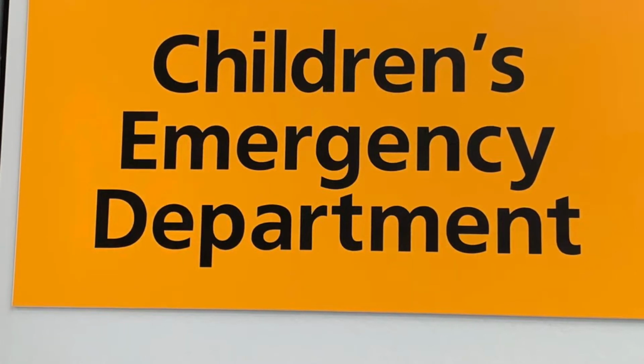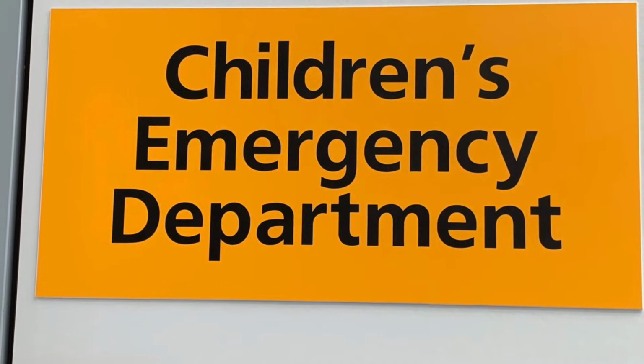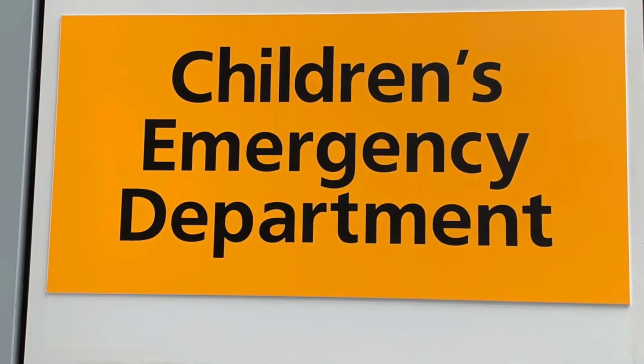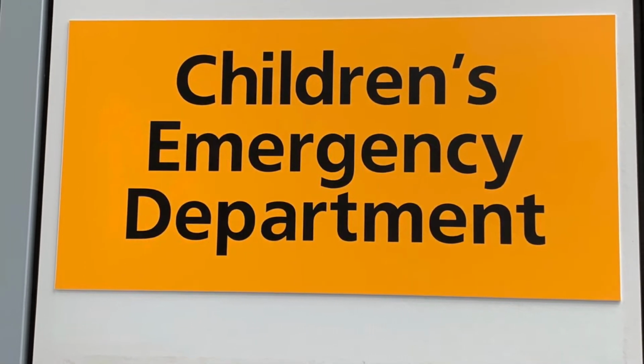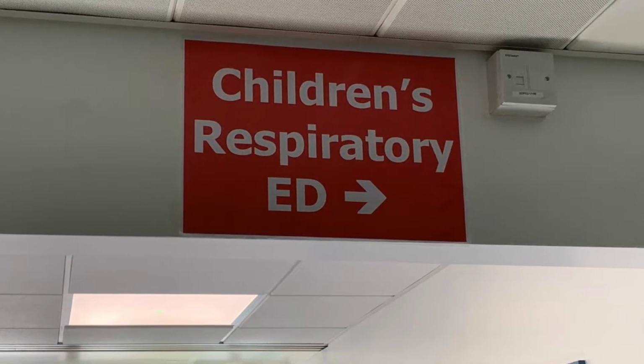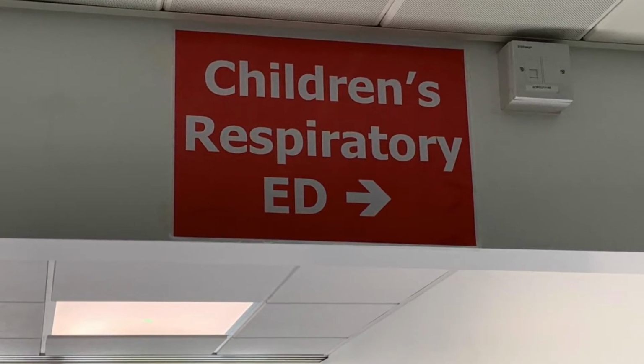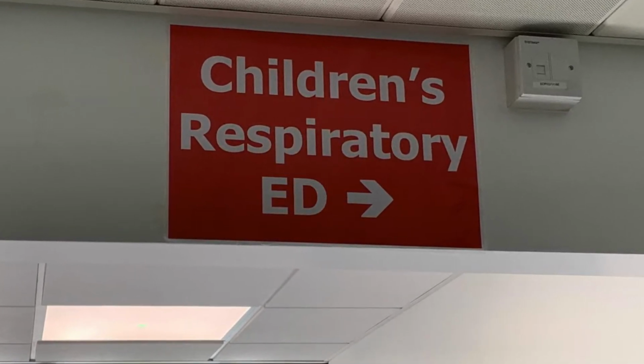Hi, this is Jiske. This is a video for anyone working in Peds A&E, nurses, pediatricians, ED doctors. We would like to take you through the new setup in Peds A&E and through a sim of a deteriorating patient needing intubation.